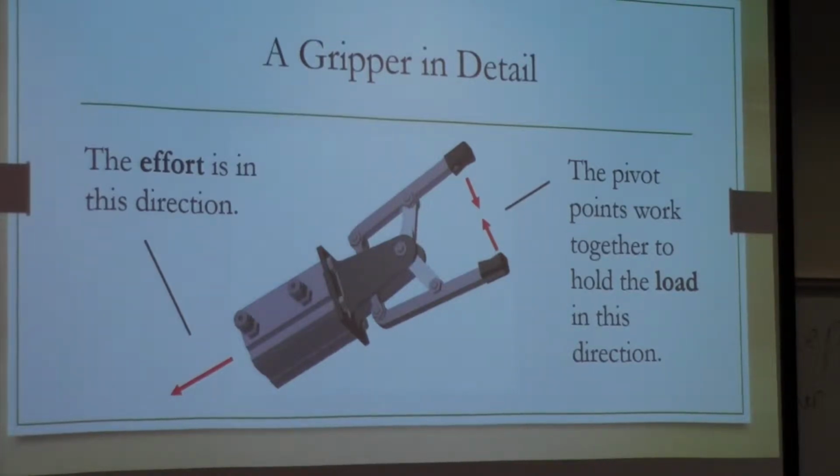So for this one you would have to attach a string and then pull on it this way. This one, it doesn't have to be a string, but if you're going to be pulling on it to actuate it, it could be a string. If you have to push it to actuate it, it's going to have to be something rigid.